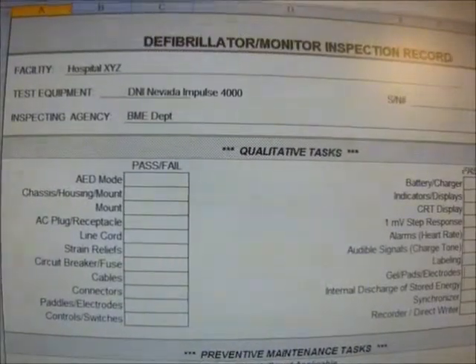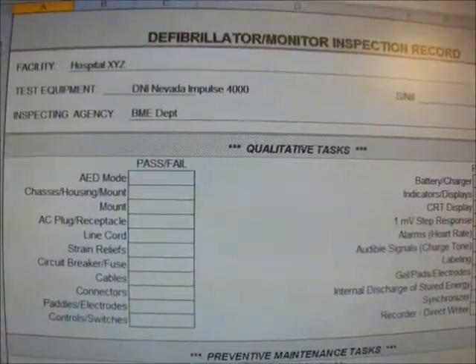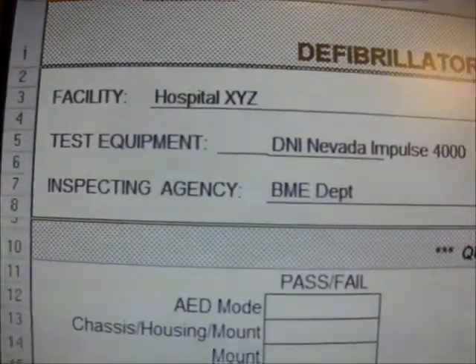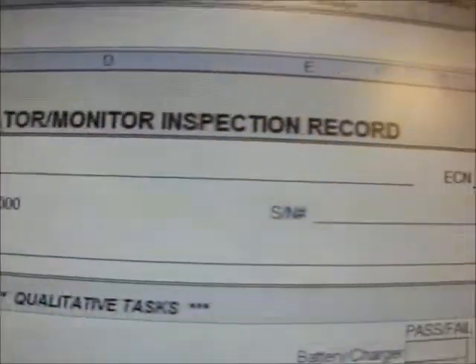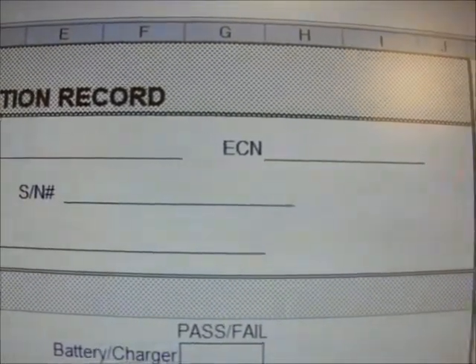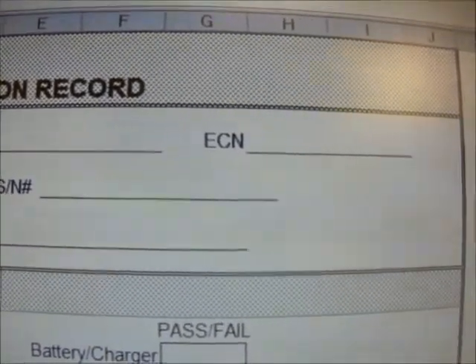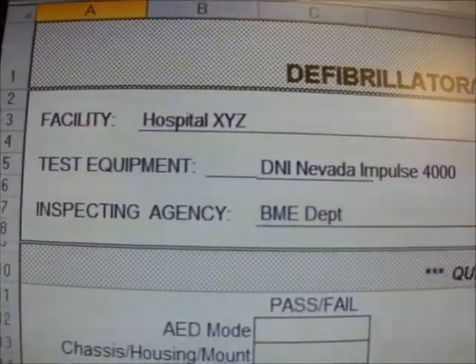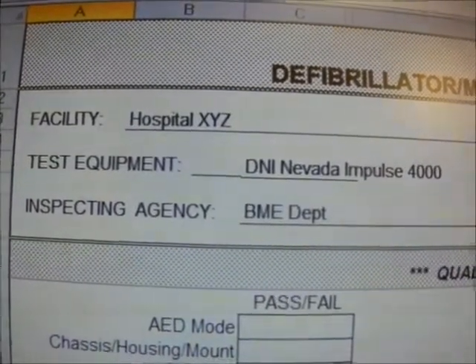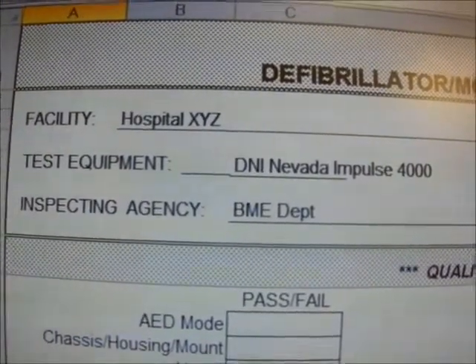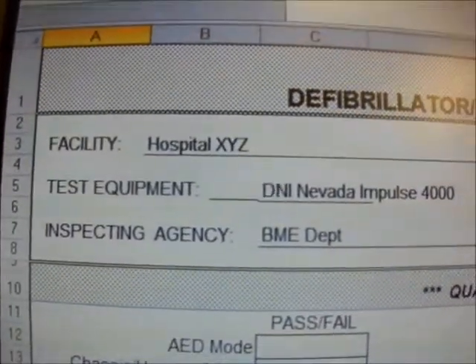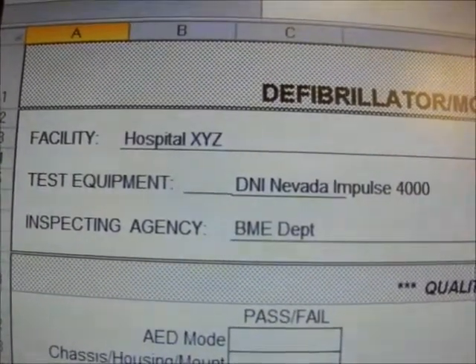This is the Defibrillator Monitor Inspection Record, or PCI. The following is the organization information: the facility name, which is Hospital XYZ; the equipment control number, or ECN, also called the index number or asset tag. We have the test equipment being used, which is the DNI Nevada Impulse 4000, followed by its serial number, as well as the inspecting agency, which is the biomedical department.